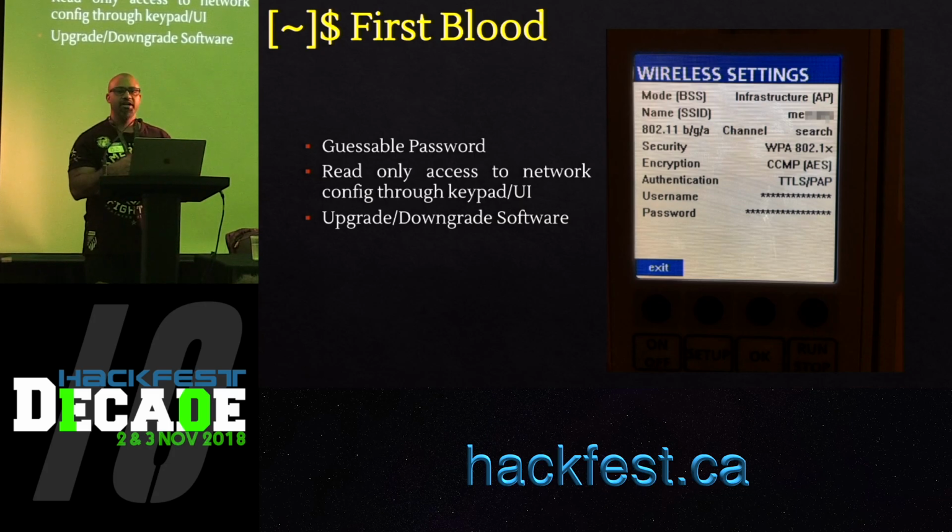So we took the very obvious logical step, because we noticed that there was an IRDA port exposed. From a pen tester's perspective, our next goal was to connect this infusion pump to our wireless network. So we brought up our own access point, configured it with the same settings as on the infusion pump, but it didn't connect. The reason it did not connect was because it came pre-configured with a username and password, and we didn't know that username and password, and we couldn't change it on the infusion pump. So we were kind of stuck.